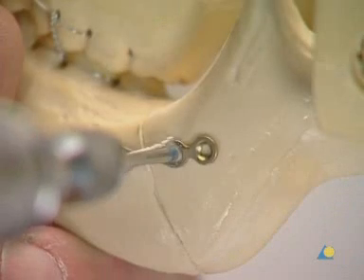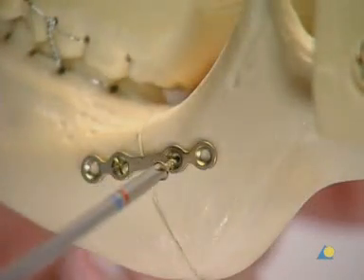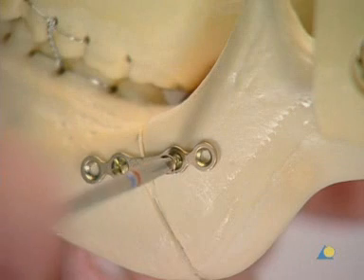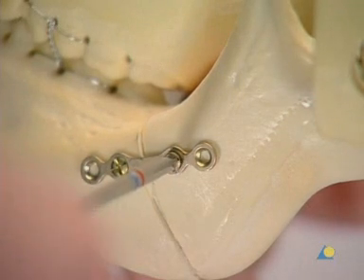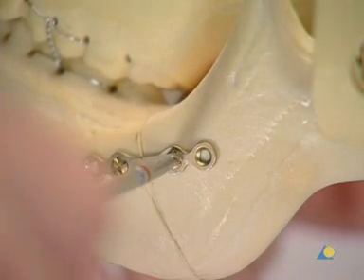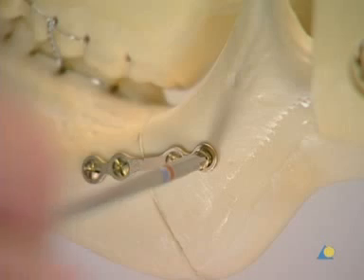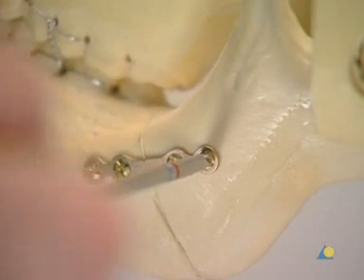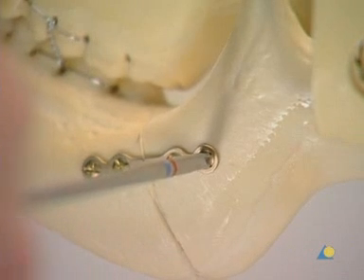The second screw is put in on the opposite side of the fracture line using the same technique. The remaining screws are inserted, and every screw is then securely tightened.